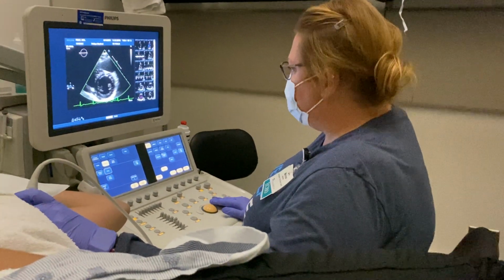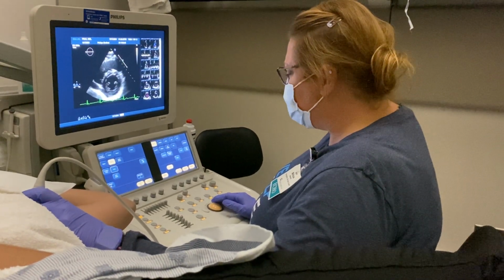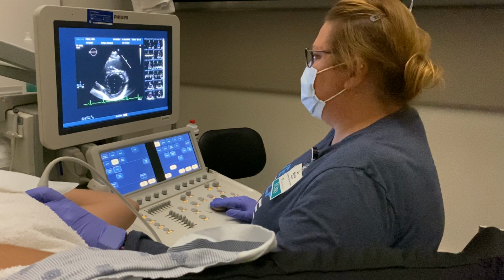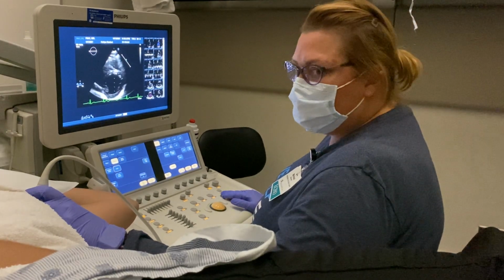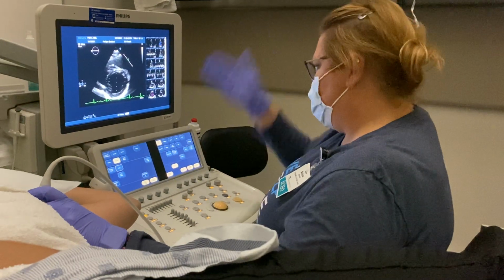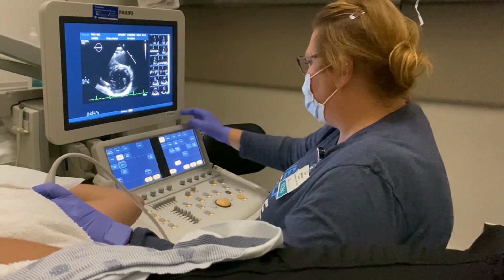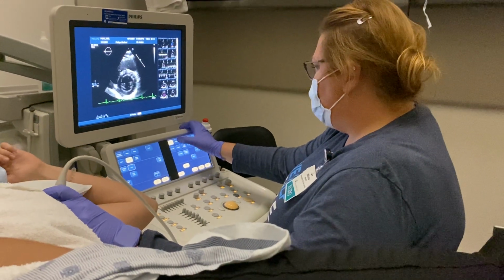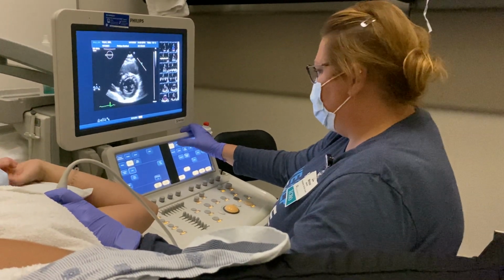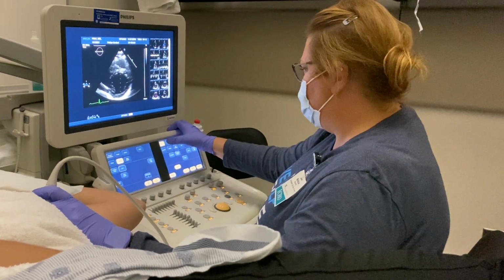Now this will be one of the times that you are going to be performing in M mode. So you're going to get your cursor ready. It's done at the papillary level or mid-ventricular level. Notice how my cursor is nice and straight up and down. And a circular LV and a little bit of RV on top. I'm going to press the M mode button. I think our machine is overheating again.